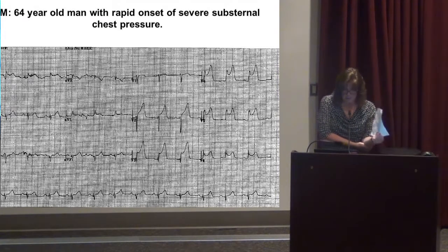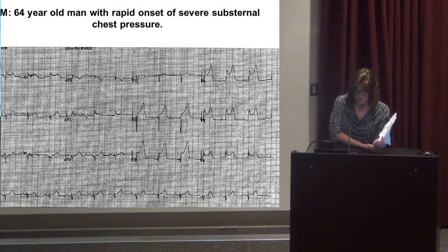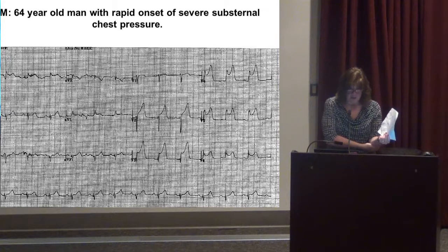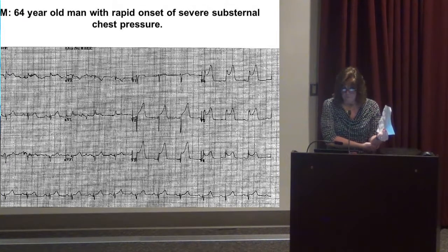Start from the beginning. Lead 1, elevated. A little. Go to the other leads in that group. AVL? Maybe. What else is in that group? 1, AVL, V5 and V6. Those are all your lateral leads. Are those elevated? Significantly so. And so lateral for sure. Sometimes lateral doesn't stand alone. It kind of attaches to another wall, like the inferior and the anterior.